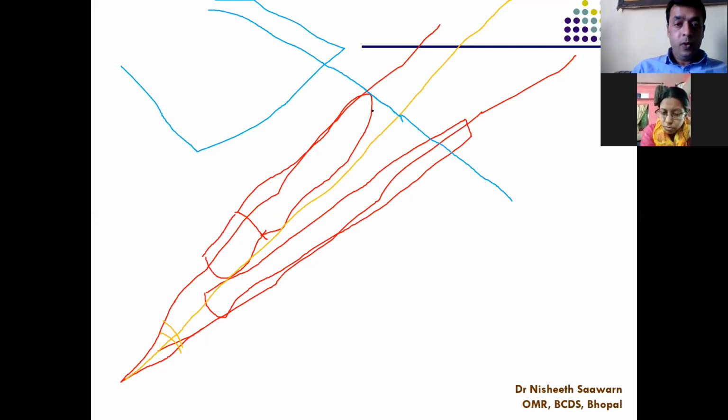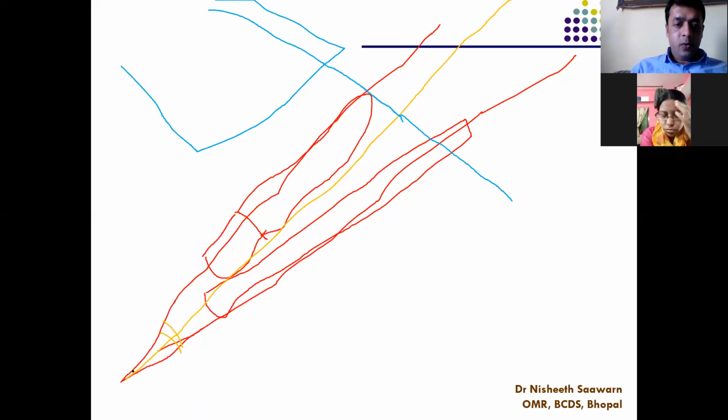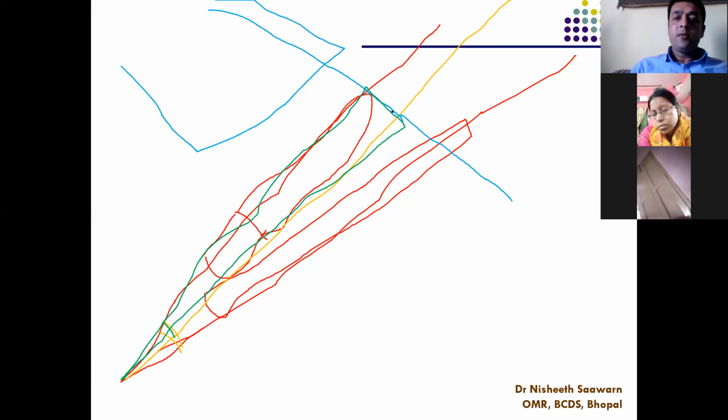One triangle is like this here. I'll outline the triangle with another color pen, we'll outline it with green. So one triangle is formed like this. This triangle has the angle which was bisected. This central ray bisecting line is common, and this was at 90 degrees.